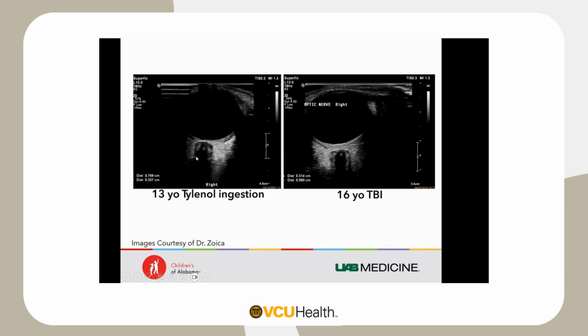Right now, all the literature is pointing that we're going to measure the exterior diameter at this moment, but making sure that you can see both diameters, meaning you have a nice head-on view of your axis and you're not getting an off-axis cut. And we'll talk a little bit about why that matters.